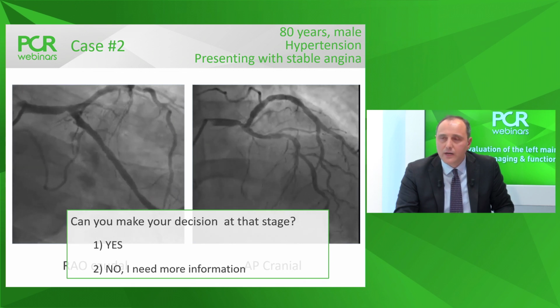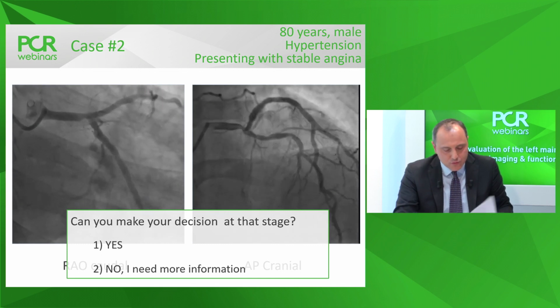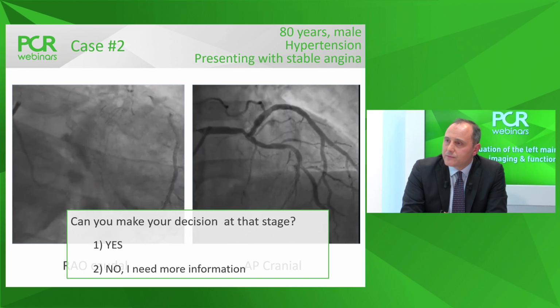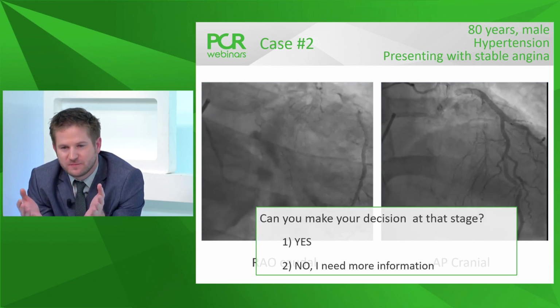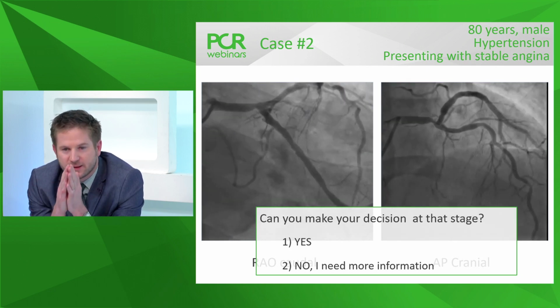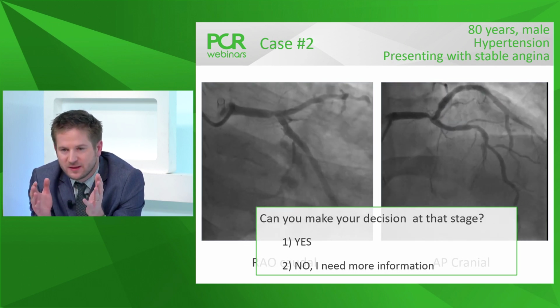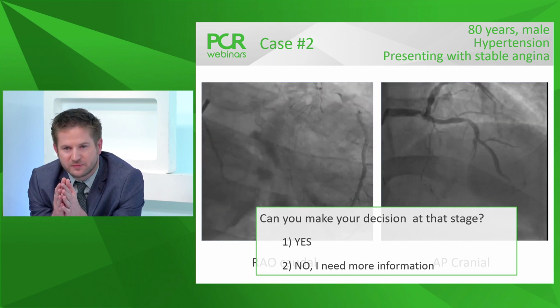I would invite the colleagues from home to reflect, and the colleagues here in the studio: can you take your decision at this stage, Gabor? Well, to summarize, definitely not. As discussed at the beginning, of course, as compared to the first image we saw at the beginning of this session, Alaide performed other projections to have the best view, but still, from these additional views we just understood the complexity of the case.